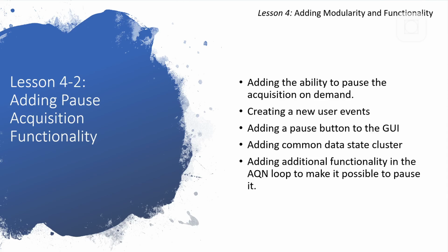We'll also be adding a common data cluster. In this cluster, we will keep the initial values of the application. In both the GUI and the acquisition, there will need to be decided an initial state. Either the program starts with running or it starts by being paused.